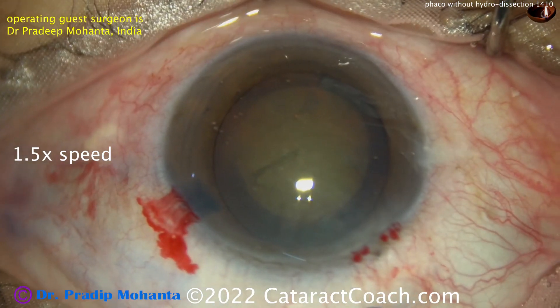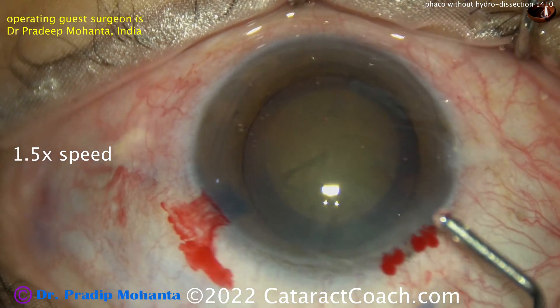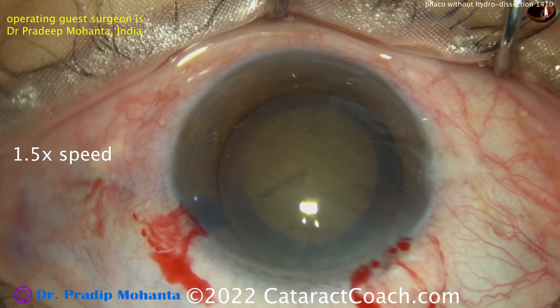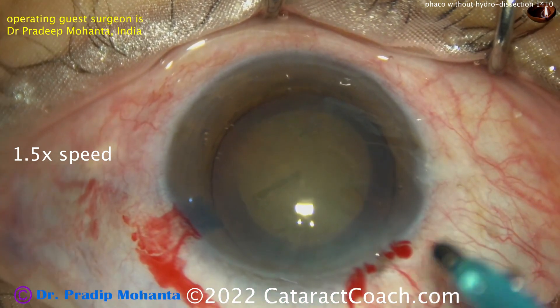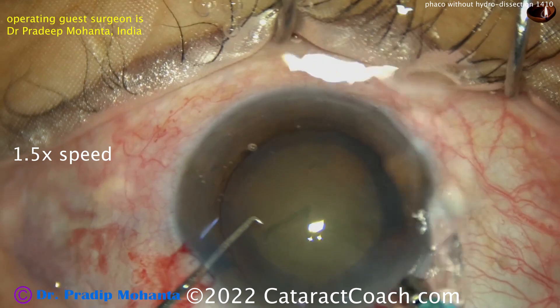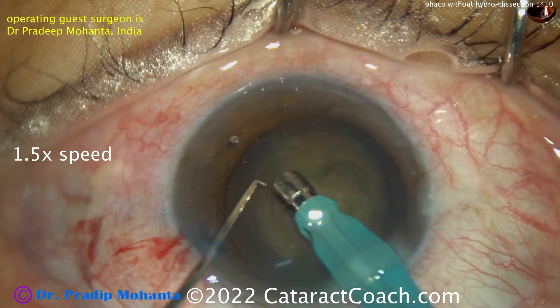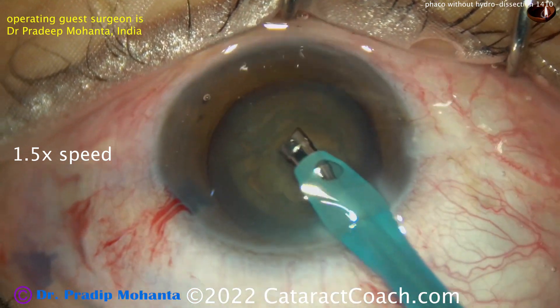The old Kelman V-groove technique can be used to split up a nucleus without doing hydrodissection and without rotating it. In this case, they're going to chop. Because there's no hydrodissection — and no hydrodelineation either — you're not going to be able to rotate the nucleus very easily. So the approach is to clean up some anterior cortex and then chop right off the bat.